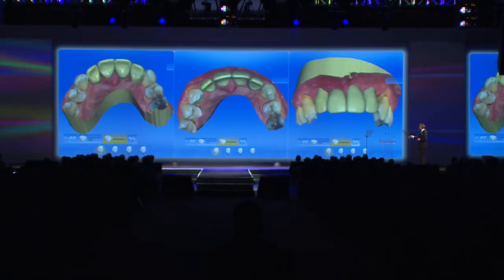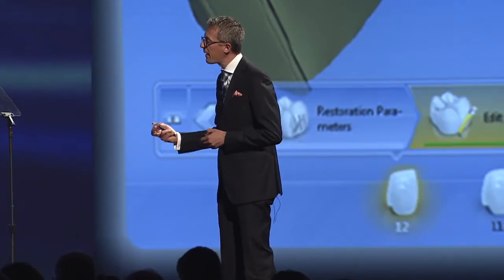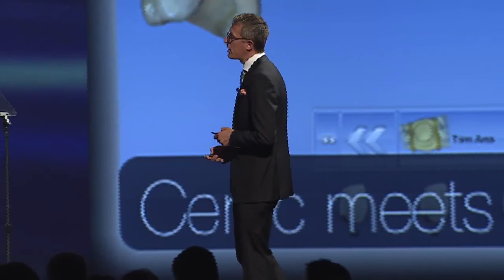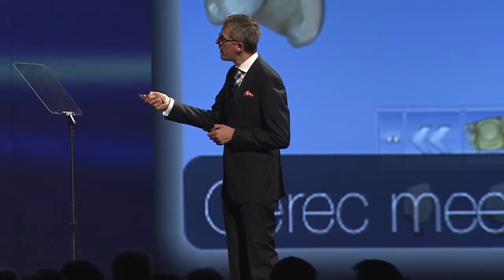You can see them here on the model. Here, this is the virtual prosthetic planning, and this helps us to do the final implant planning and implant treatment. So, you know, the CEREC meets Galileos integration. We have both sets of data shown in this window here.